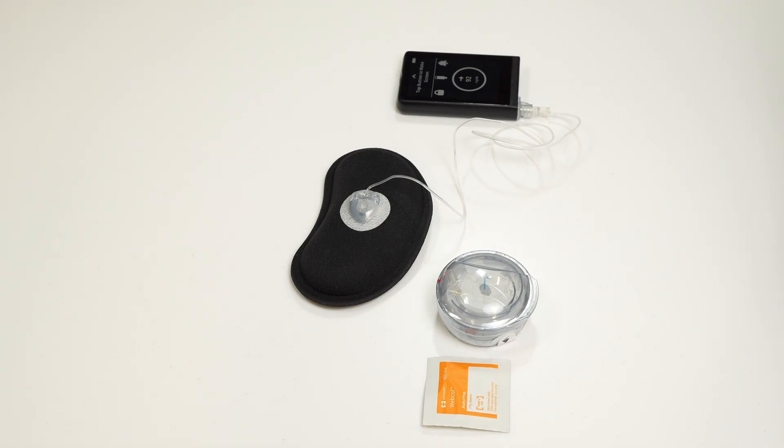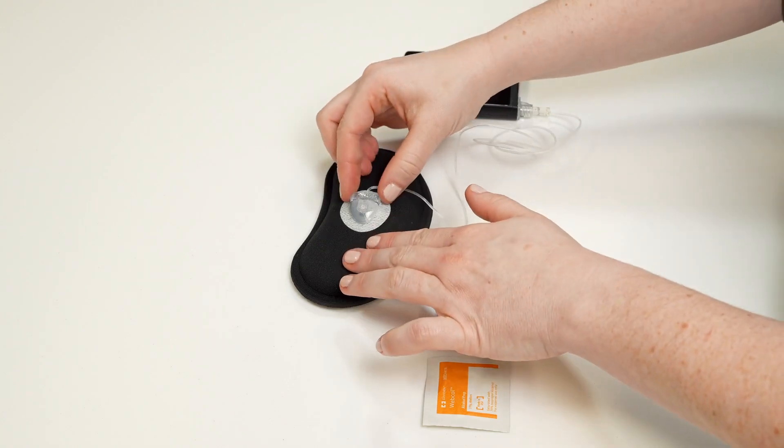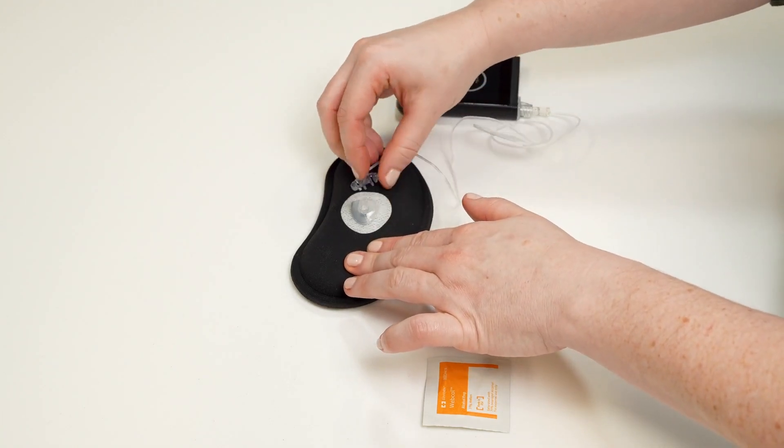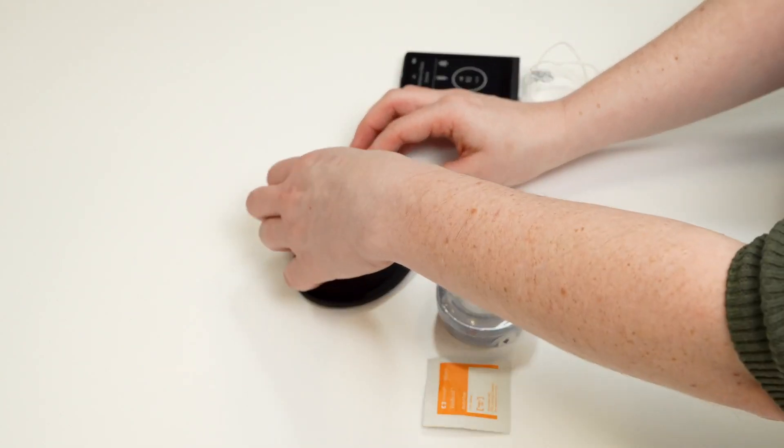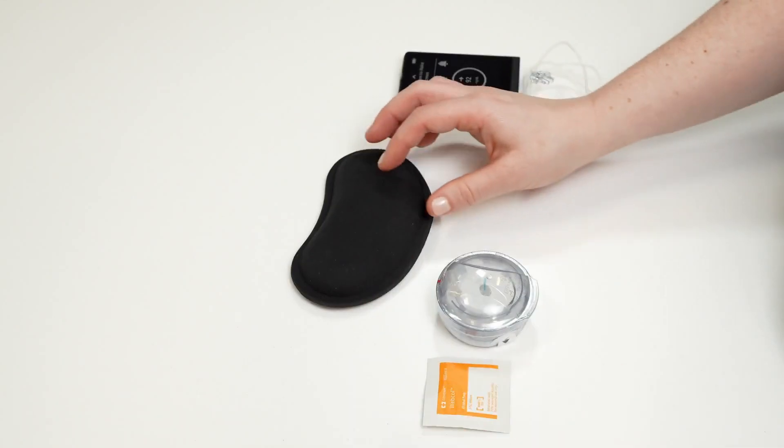First, disconnect your tubing from your infusion set base and gently peel the old infusion set off of your body. Clean your skin.